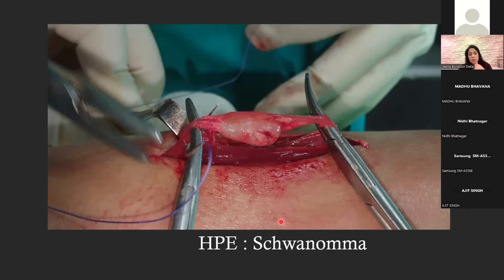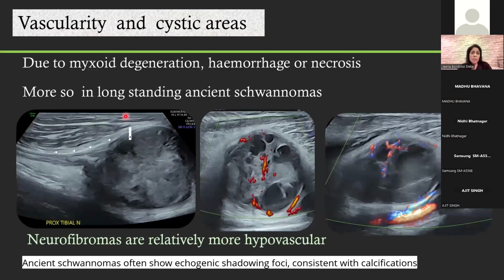And the histopathological correlation revealed it to be a schwannoma. So another feature that we've got to look for in soft tissue tumors and nerve tumors is the vascularity and the cystic areas. Now, vascularity is more seen in schwannomas, and neurofibromas are relatively more hypovascular. And necrosis can take place; the cystic areas are mainly seen due to myxoid degeneration, hemorrhage, or necrosis. And these are seen more in long-standing ancient schwannomas.